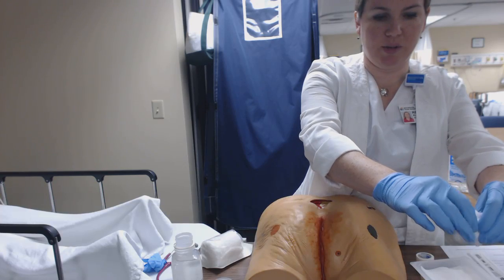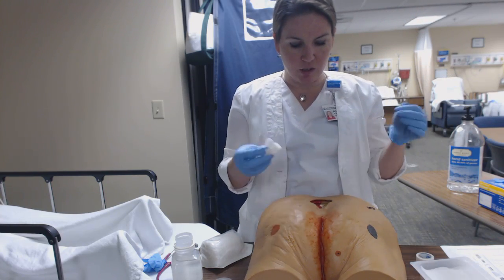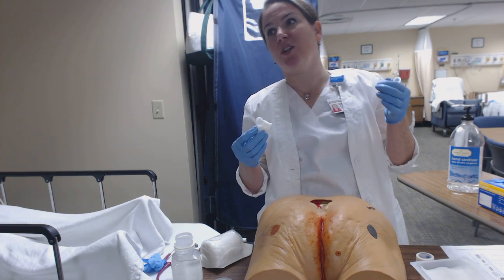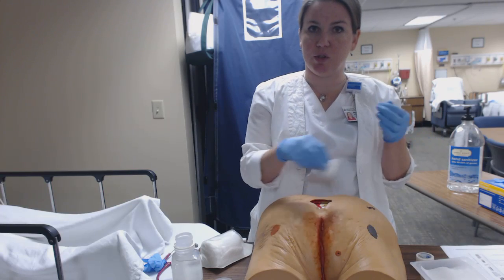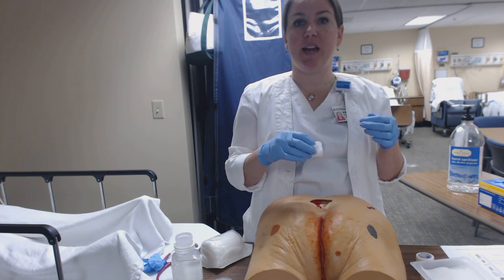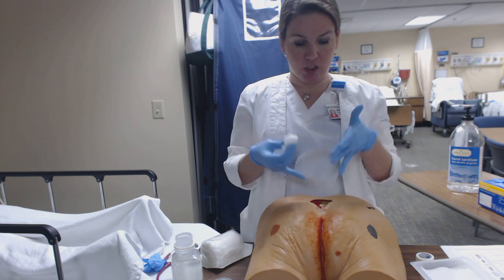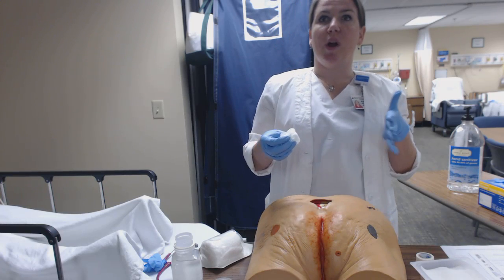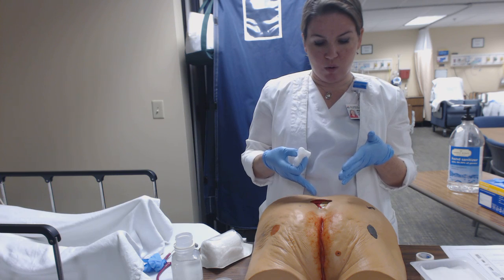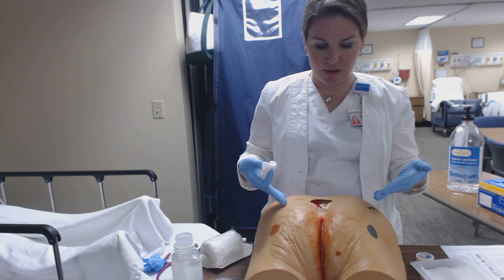And if I need to, I can squeeze it out a little bit, but we're really just cleaning the wound. Depending on where you go depends on whether you use strokes or do a circular motion in cleaning the wound. The most important thing is that you're doing clean to dirty. And even though this is a dirty wound, you want to go from the inside of the wound, or the part of the wound that has the least amount of exudate, to the outside of the wound.